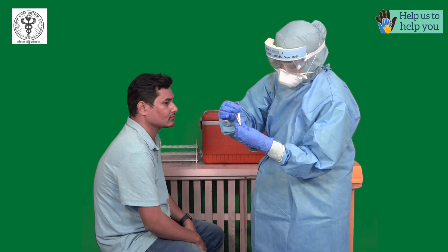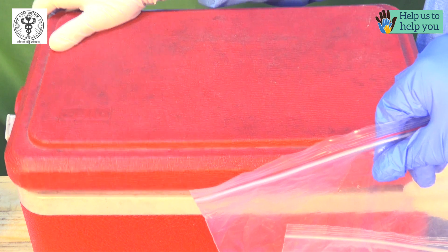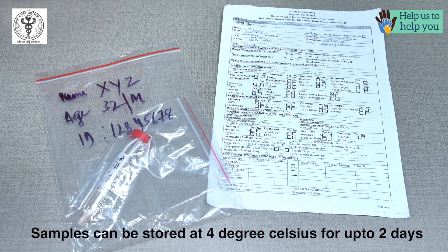Cap the vial tightly and put the vial into the double plastic pouches. Keep the sample in the icebox and transport the sample immediately to the lab. In case there is any delay, the samples can be kept at 4 degrees for up to 2 days.